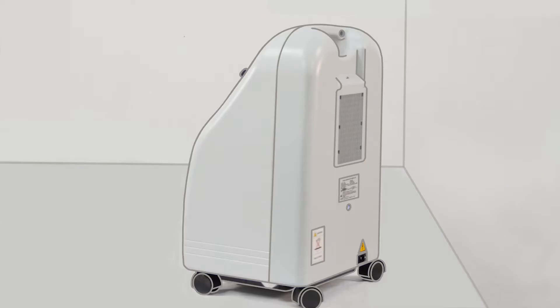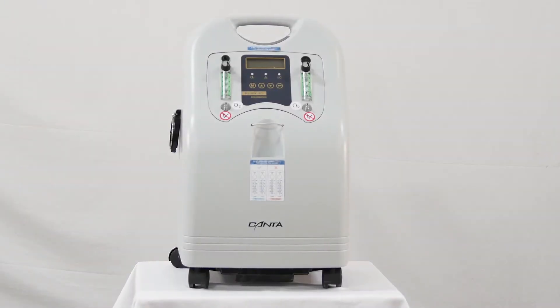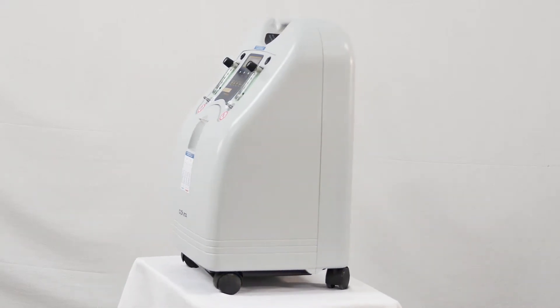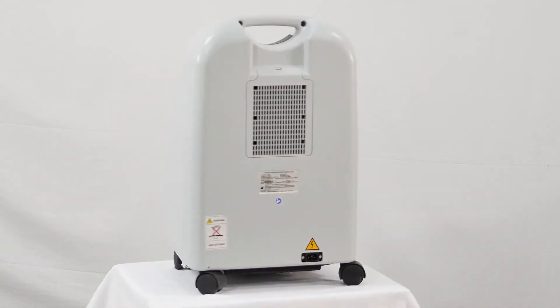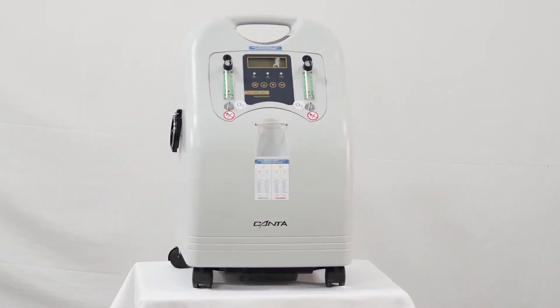What it does is it takes in air — the ambient air — and from there it filters out the nitrogen from the mixture, and what comes out at the front is oxygen. Inside the concentrator there are two large sieves. These are able to remove almost all of the nitrogen from the air, leaving more than 90% oxygen.